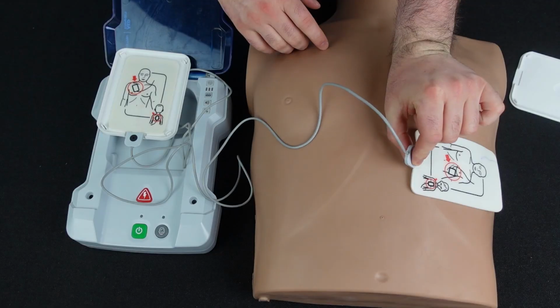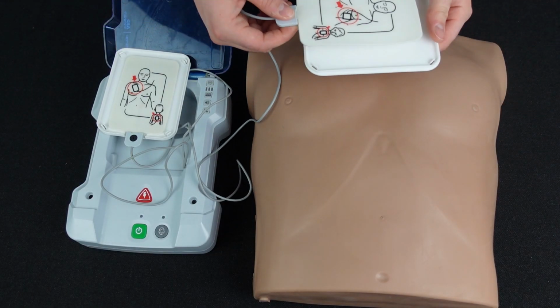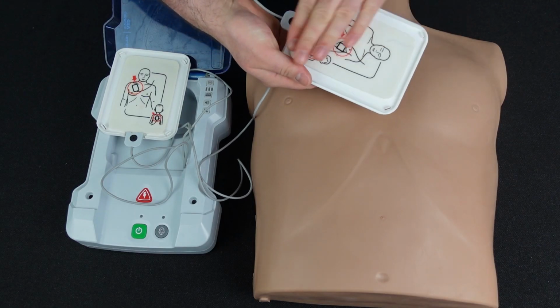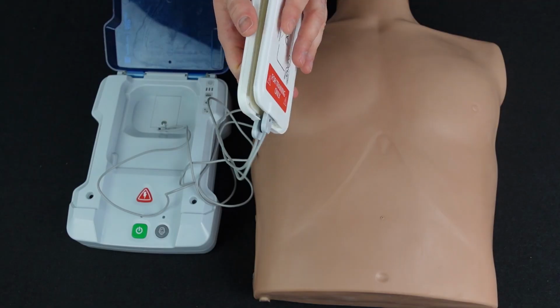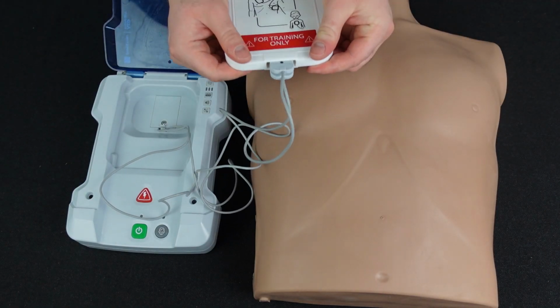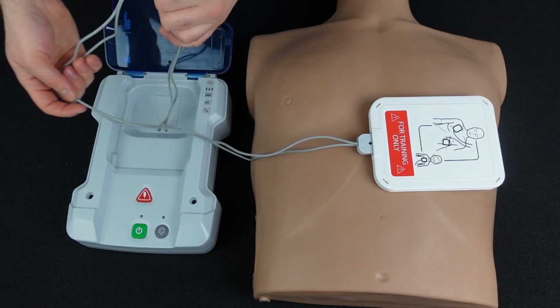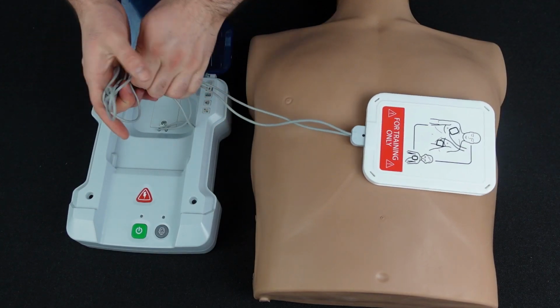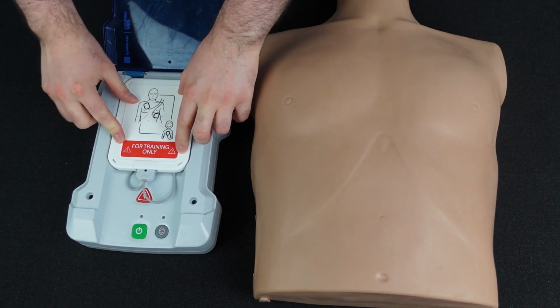Make sure the storage case is clean and lint-free, then place the pads in so that the sensor is centered. There's an indent in the plastic that keeps the sensor from touching anything while stored. This small indent prevents the AED trainer from moving on to the next steps prior to pads being placed on the mannequin during a training session. Once the pads are in the case, close the case and place it in the trainer as shown in the video.